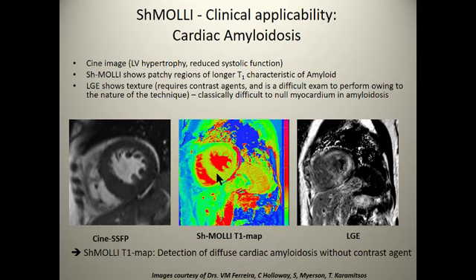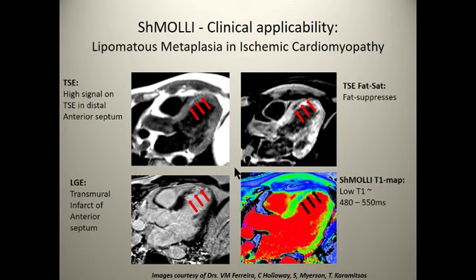Now, global changes aren't very easily detected with lots of techniques because often you're doing a comparison. So, for example, with late GAD, it would be quite difficult because you have to choose an inversion time which would correspond to black for normal tissue. As there's no normal tissue, it would be very difficult. So this is kind of a useful technique in that way, and it's kind of a very definitive statement.